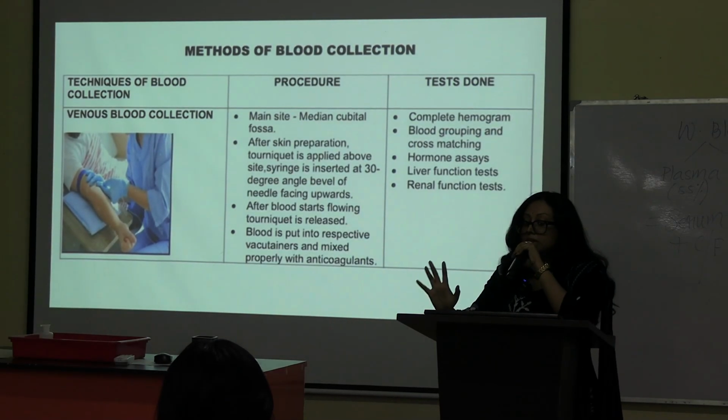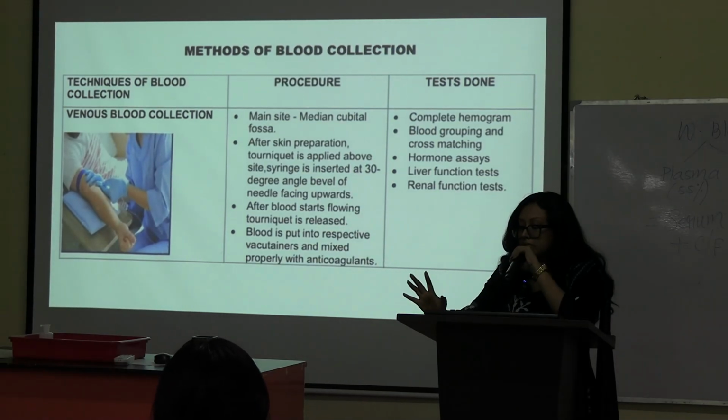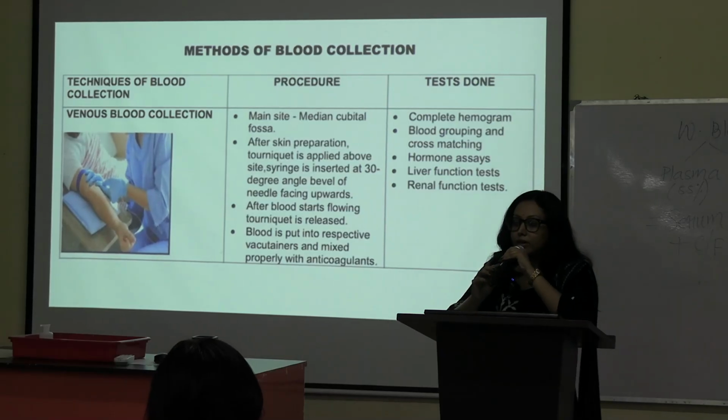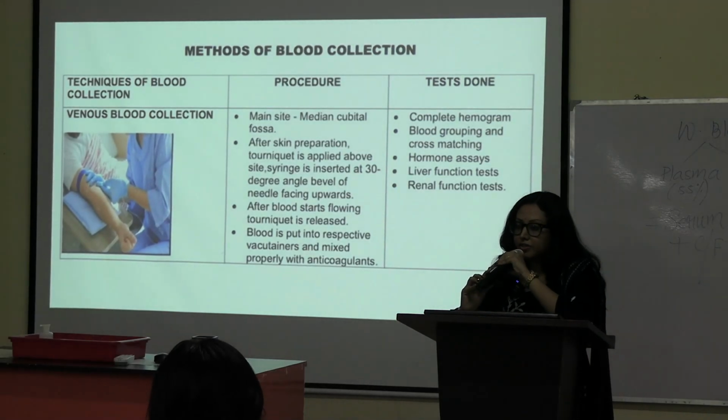You remember the median cubital vein is the vein of choice for venipuncture. It is a very, very important question for viva. So why is the median cubital vein important? Because it is the superficial one.